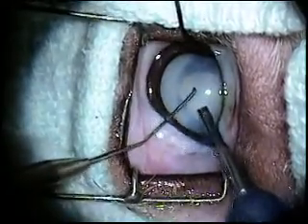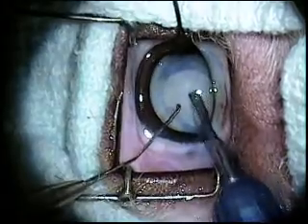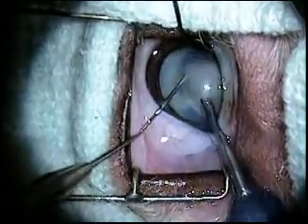Once the lens has been emulsified, the liquefied material is aspirated through the tiny needle opening.